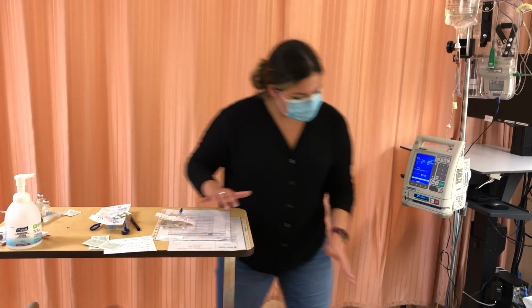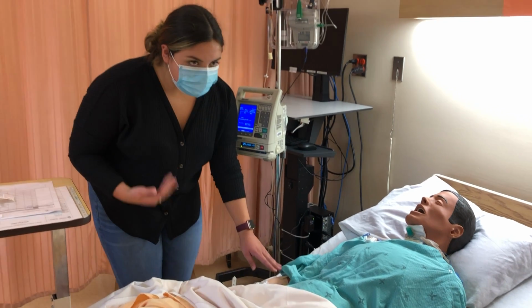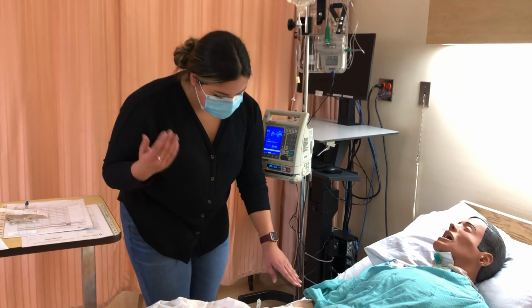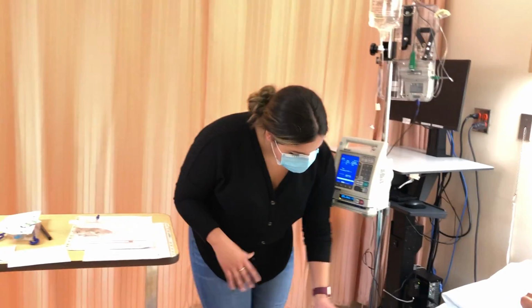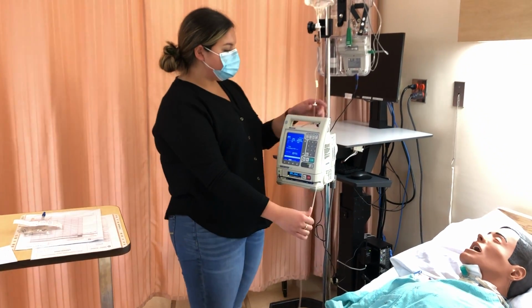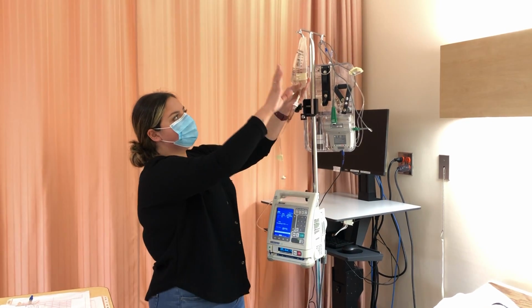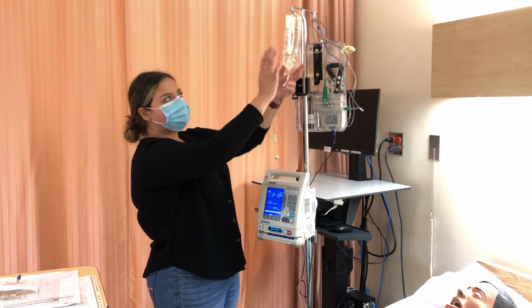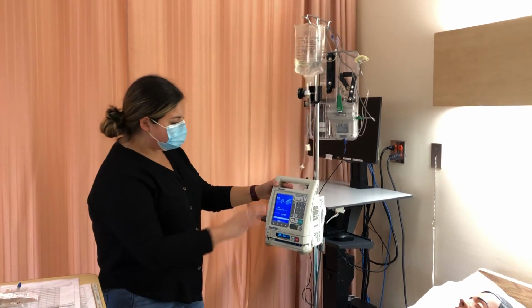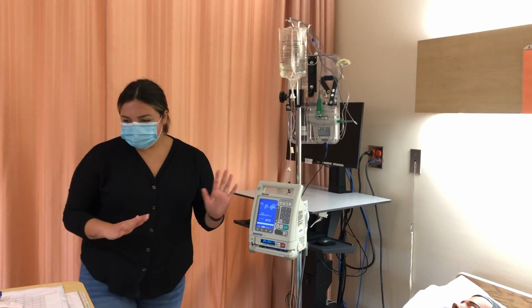So I'm assessing Emma's IV site for any signs of redness, warmth, swelling, any signs of phlebitis or inflammation. So everything looks good. There are no clamps on. The primary line looks good. The primary line is labeled, and the primary bag is labeled as well, and it has not expired. And my primary rate is running at the correct ordered rate, so everything is good to go there.